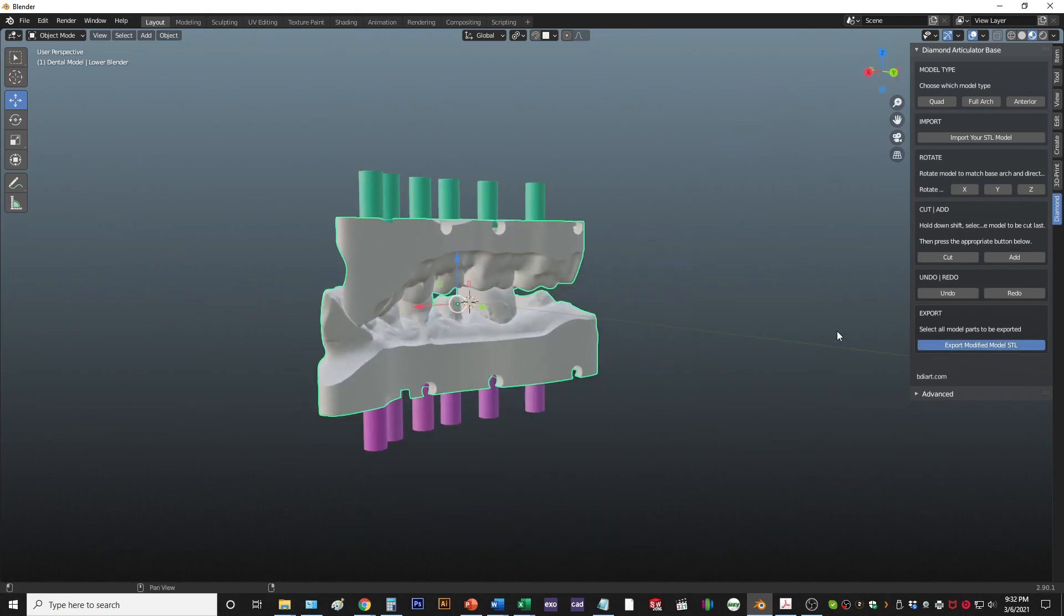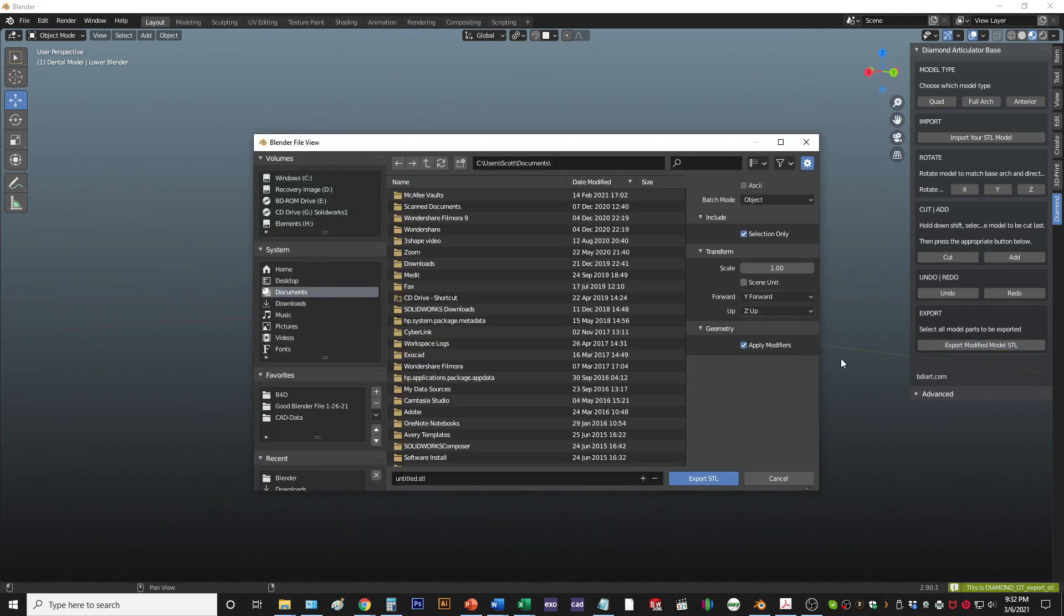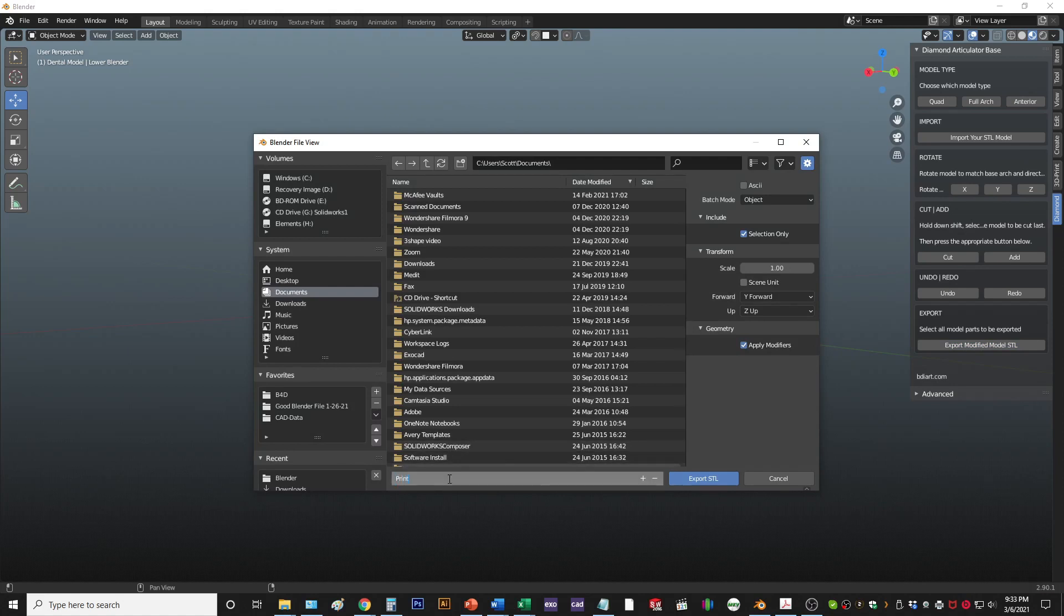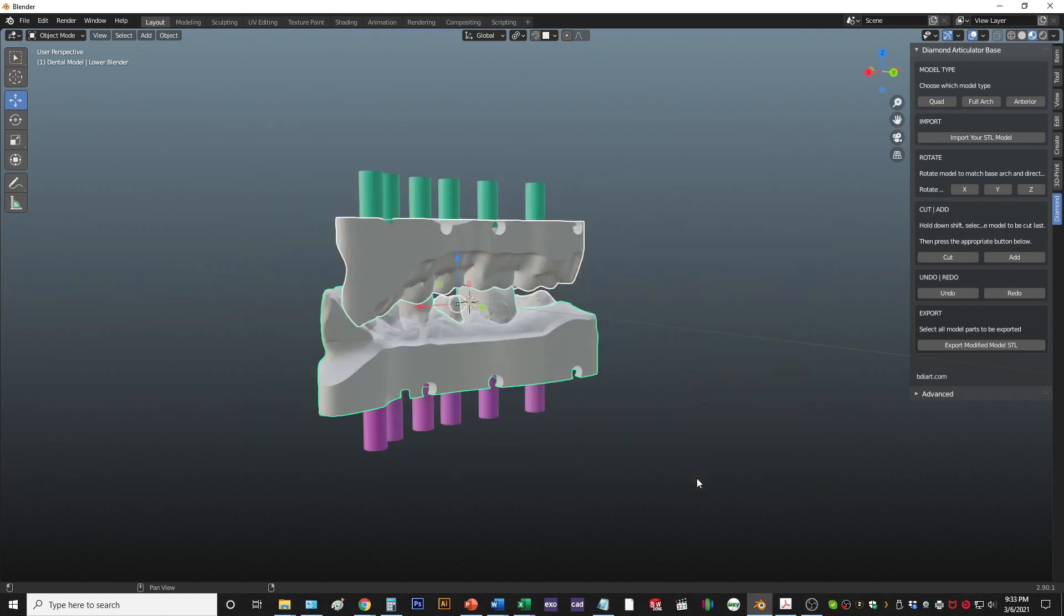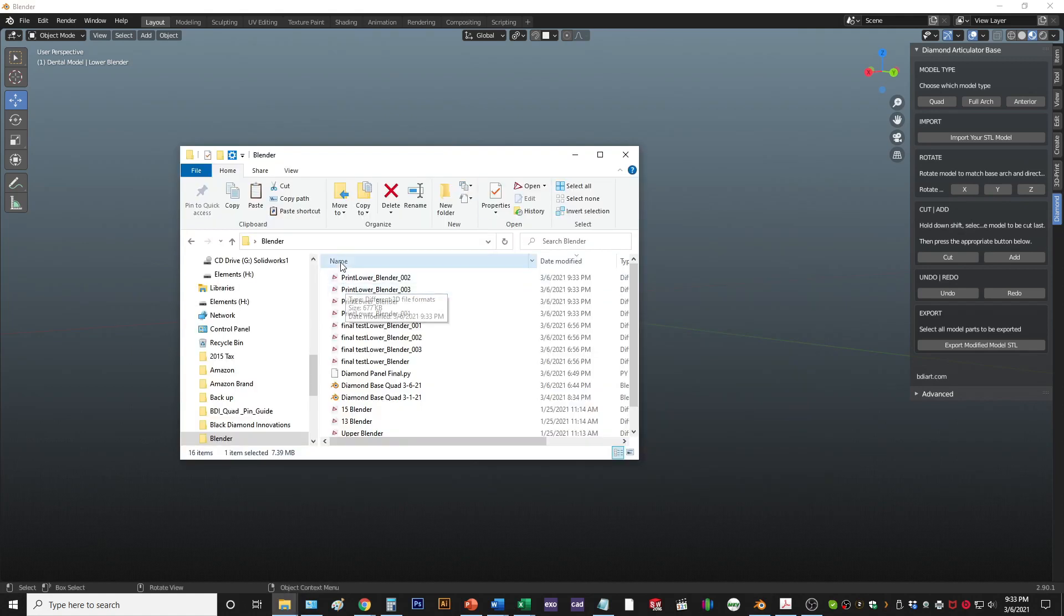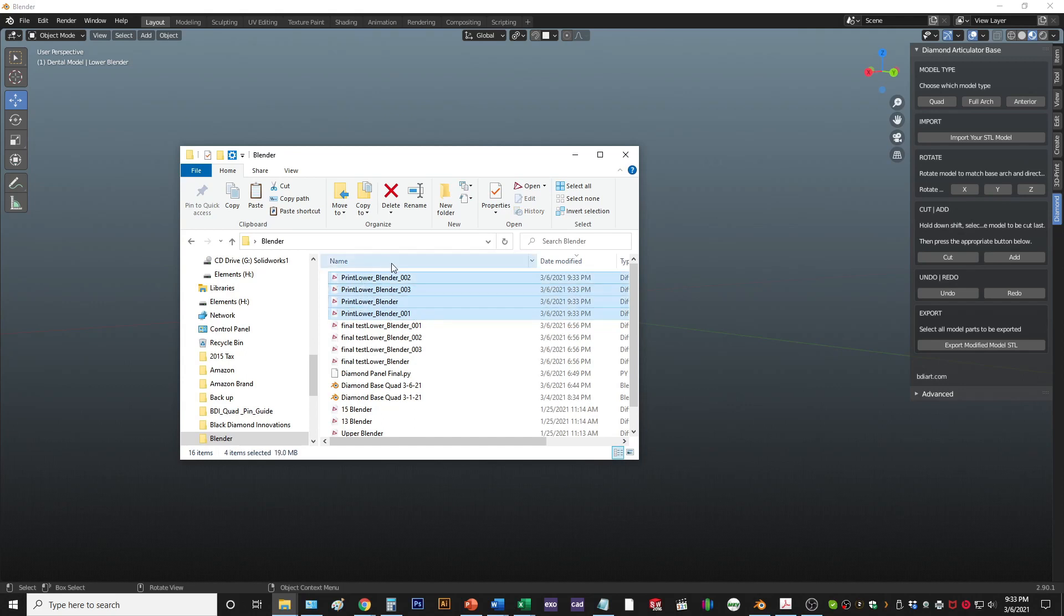Then hit save and finish. So this model will just fit directly onto the diamond articulators. Right there, and it saves it in all the different sections. So you're ready to print.